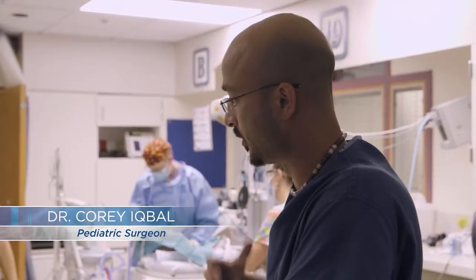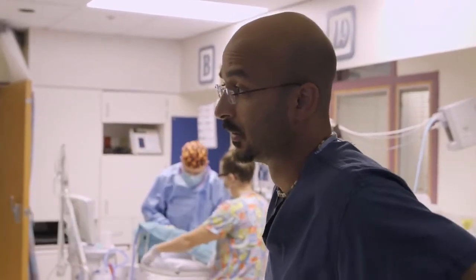So now it's really just waiting for the hypertensive crisis to subside and him to get back to baseline. Could be a couple days, could be a week, could be a couple weeks. In the extreme cases, he might not recover. The key is that whatever's causing it has to be reversible. Otherwise, the ECMO doesn't do any good.